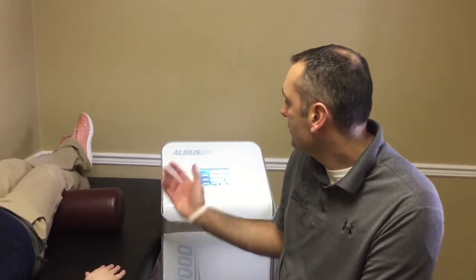Hi, I'm Brian Kuchman, the physical therapist at Precision Orthopedics. This is the Cryophos, which is one of our new treatments. We are one of two places in the United States that has this. This is basically liquid CO2 in the form of cryotherapy.